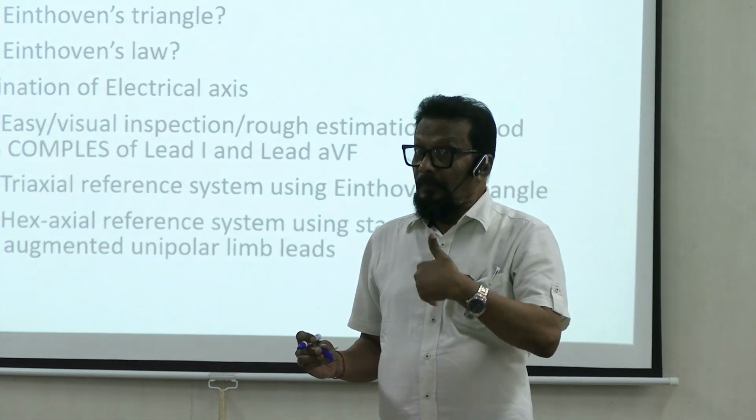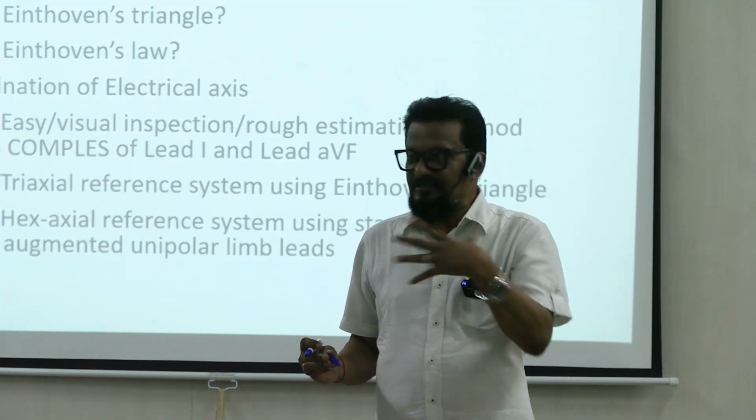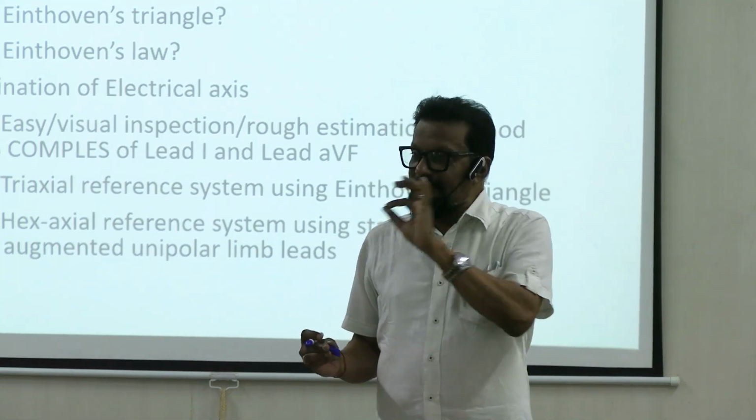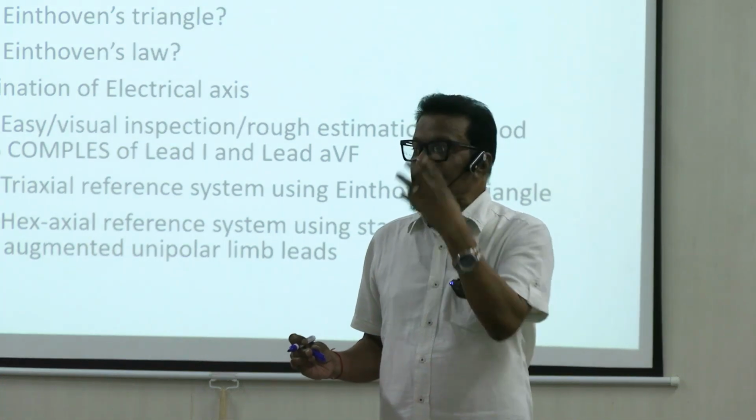These chest leads see the heart from different locations, and they are important in localizing the pathology, suppose infarction.